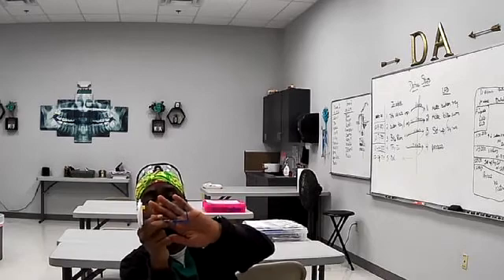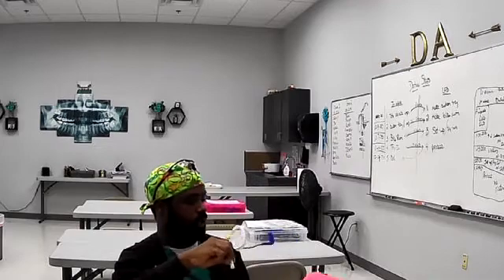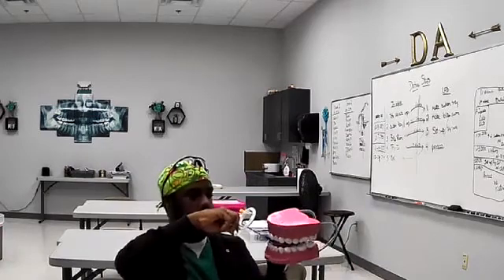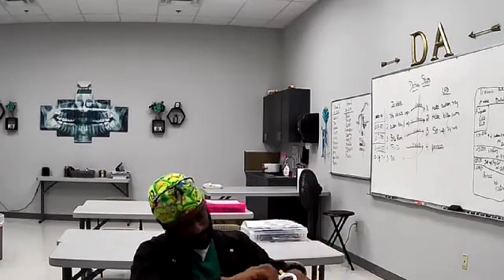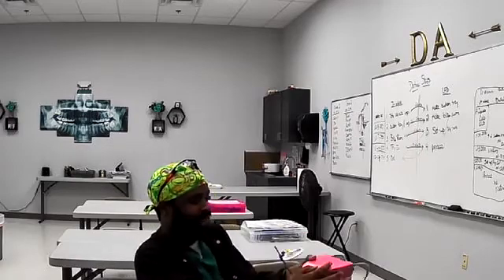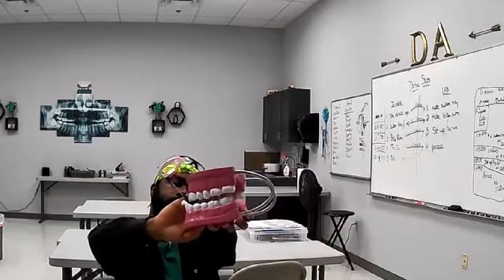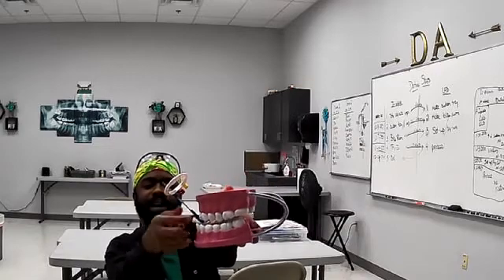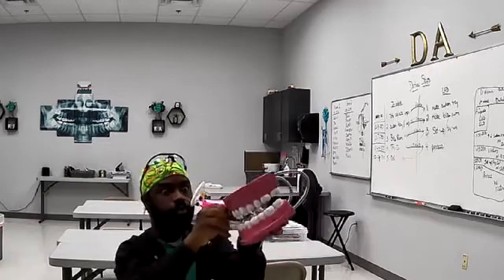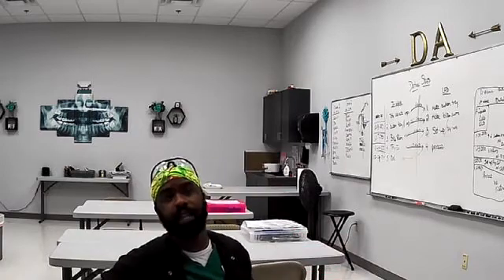So on the thin ones like these, you want to get your little cotton roll. You go ahead and place your sensor where it needs to be. And before you get the patient to bite down, you will place a cotton roll right at the bottom. That way the bite is not digging into the lower teeth, or the actual gums on the bottom. And that was for the anterior PA.